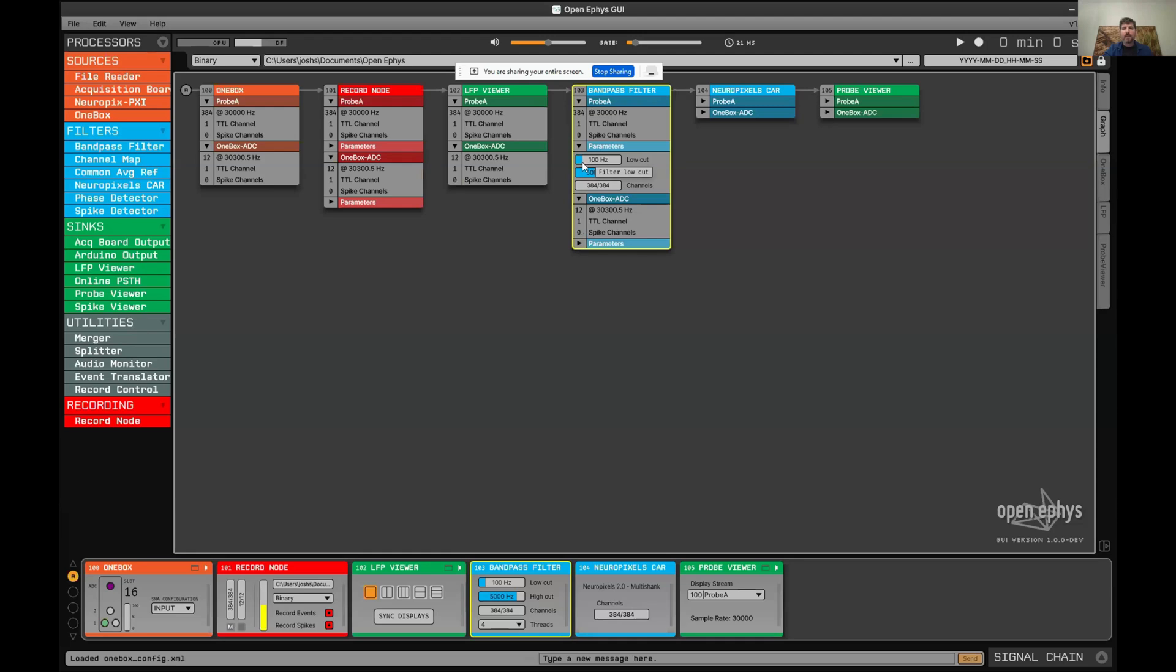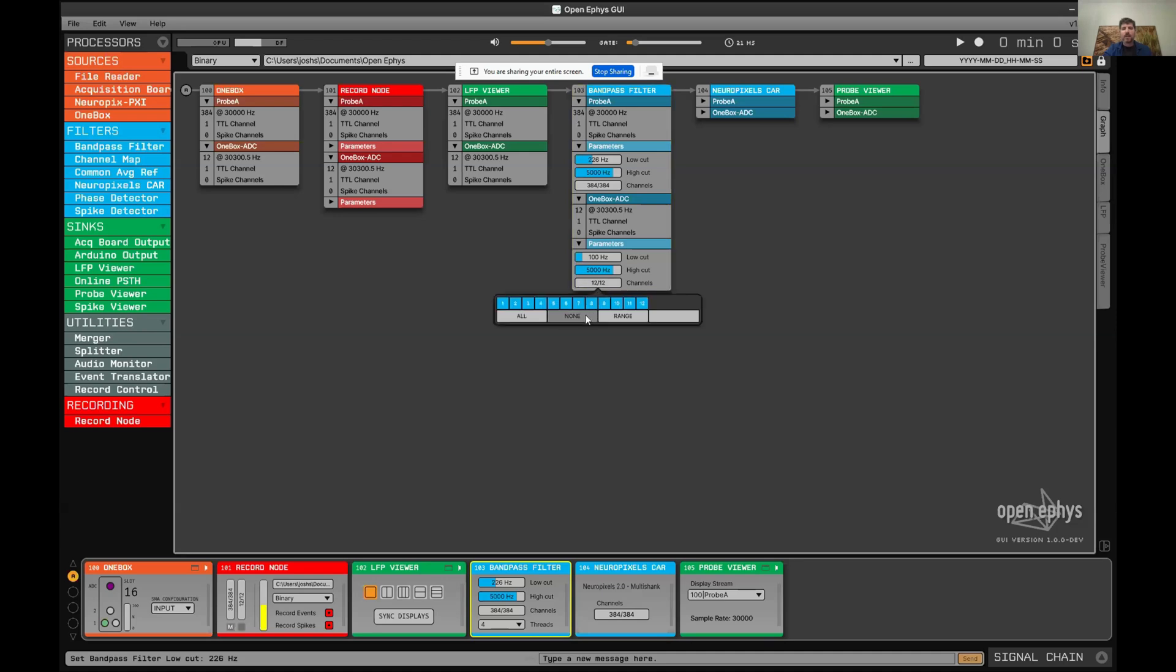Each of all of these parameters are going to be set independently for each stream. For example, for the ADCs, if you want to turn off the filter entirely, you can select no channels here, and it will disable the filter.